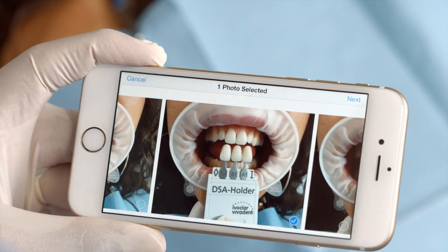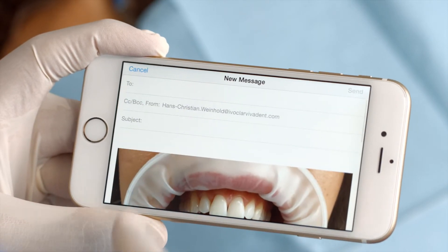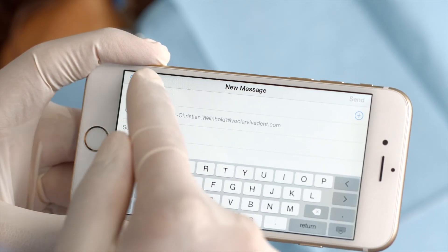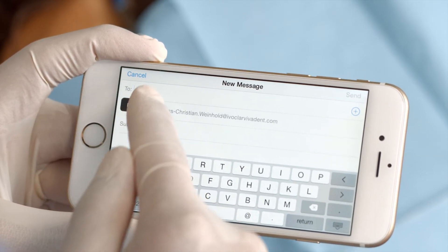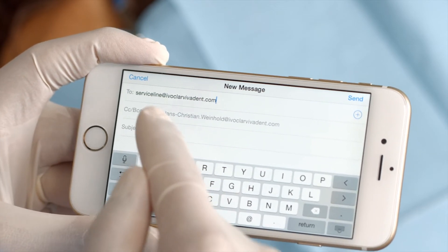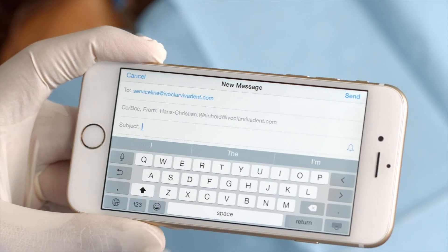Once the photographs are taken, they can be sent as a JPEG file via email, USB stick, or SD card to the user of the Programmat furnace.